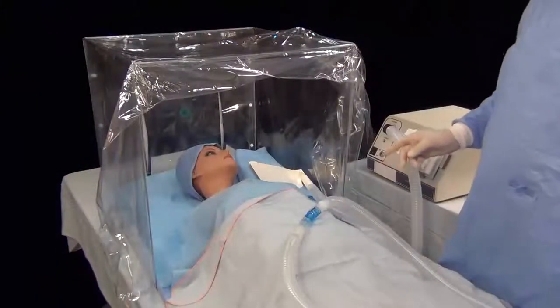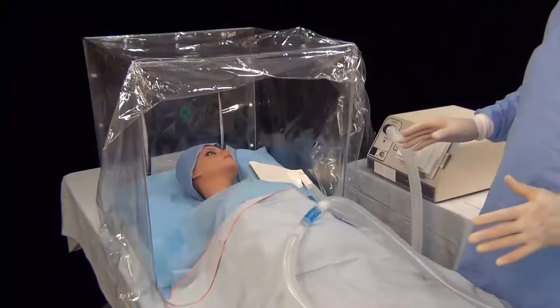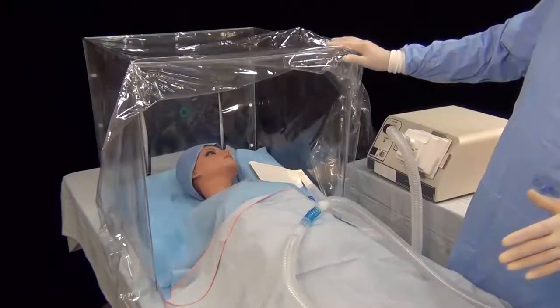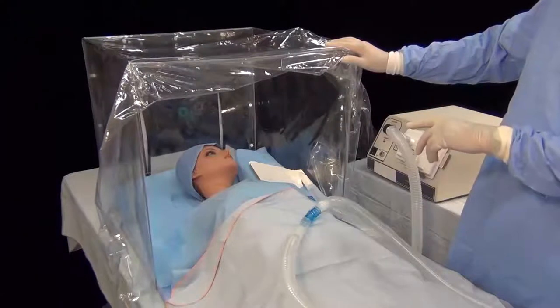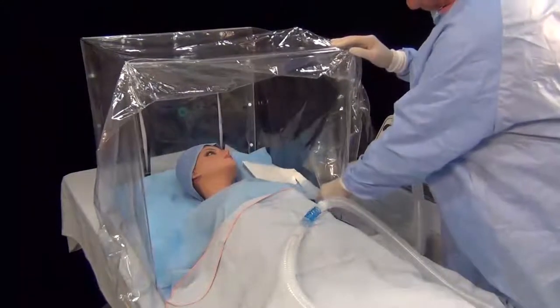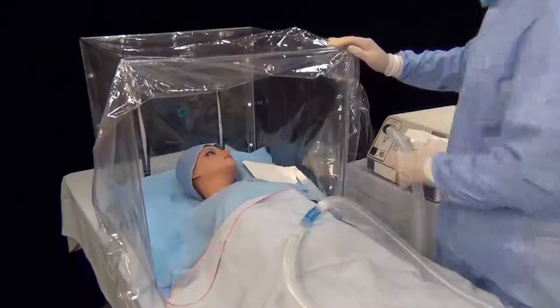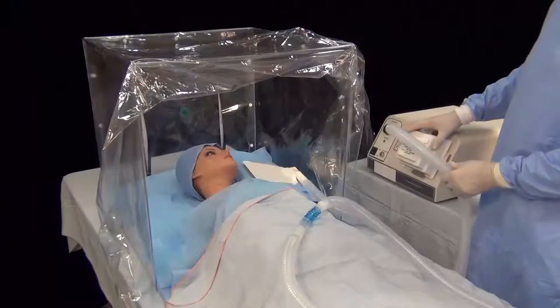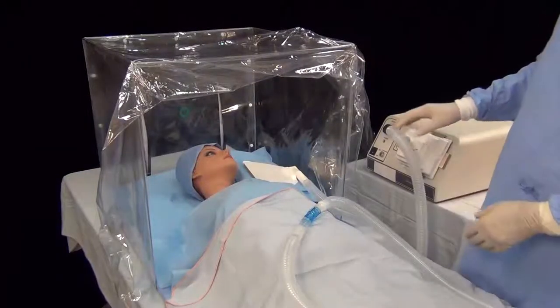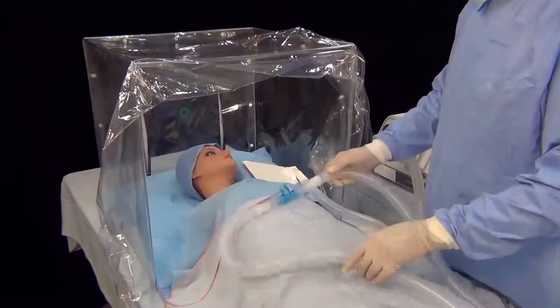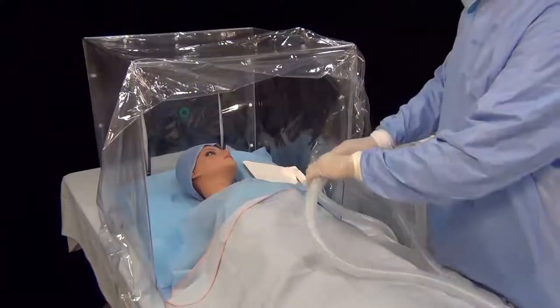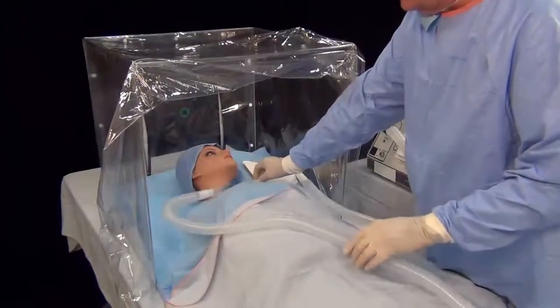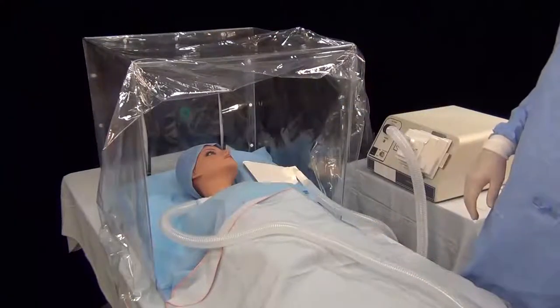Now that the tent has been constructed, I'd like to show you how all the components come together. So the tent at this point has three sides. The patient has been placed inside. The Mini Square has been placed adjacent to the patient's head and neck area to collect the viral aerosol. It in turn has been connected to a HEPA filter and smoke evacuator. The last stage in preparation for intubation will be placement of the respiratory tubing close to the patient's head and neck area.